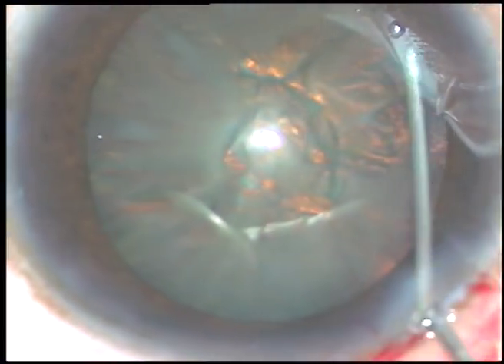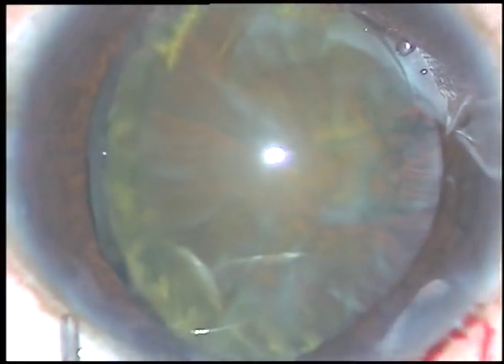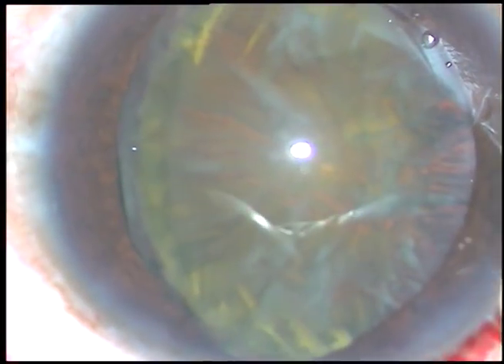Now see what happens with hydrodissection — one pole, one equator of the lens has prolapsed out of the capsular bag.